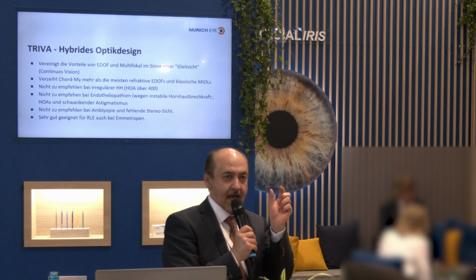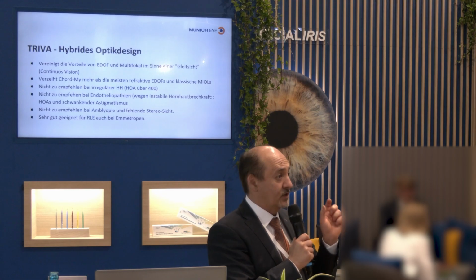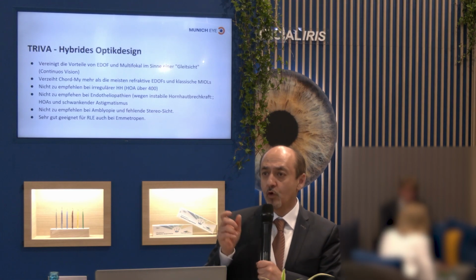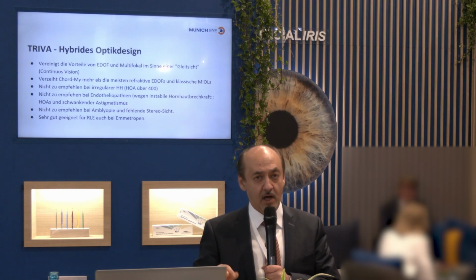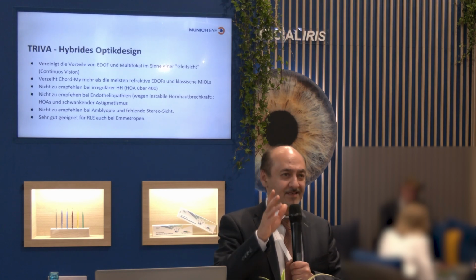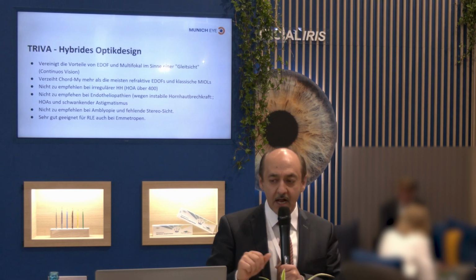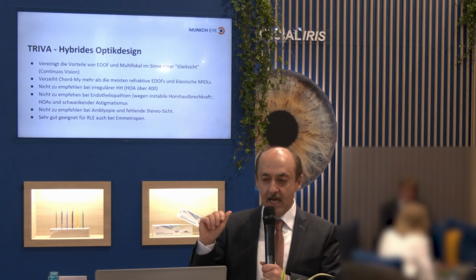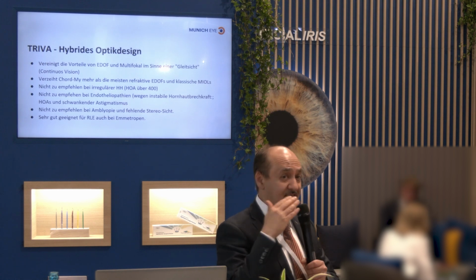Because I have a relatively large monofocal element in the middle, I avoid an otherwise big problem with diffractive optics, namely when the patients have a high chord mu value. So pupil decentering, we are all afraid of it. So especially the refractive surgeons. So if you see, oh, over 300 and you don't know, yes, that can cost him the distance. And that's why we've always been reluctant to use multifocal lenses. Some isofocal lenses are more forgiving, but this lens, in my personal experience, actually forgives up to 400 microns of pupil decentration.